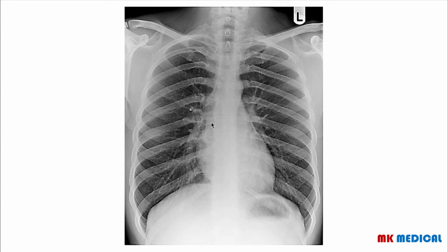So the first thing that we're checking is demographics. We've checked that the demographics are there, assuming that they are there. Of course, they're not depicted here. We check for the presence of the side marking, which is, of course, this side telling us that this side of the X-ray is the left. We check for the technicality of the X-ray to see if this person is well centered, so we can see these spinous processes and the medial ends of the clavicles. This distance appears to be roughly equal, so this person is well centered.